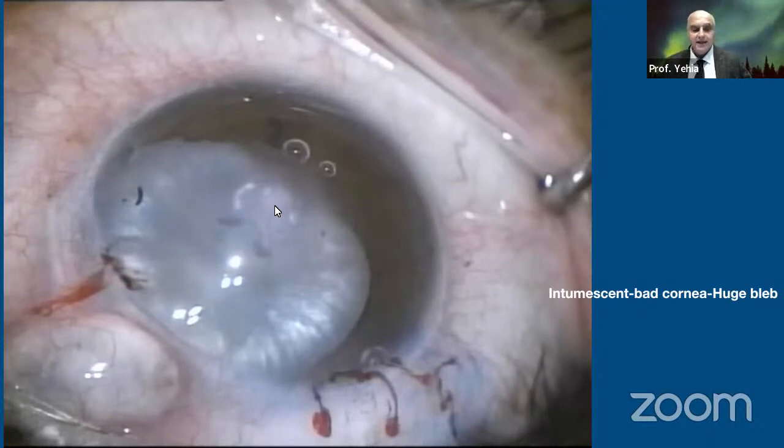One of them is this functioning bleb. Is it functioning or not functioning? We have to check the pressure. And if it is functioning and it's overfiltrating, you might be faced with a case of hypotony. Doing phaco surgery in a hypotonous eye is not easy because the anterior chamber tends to deepen and makes surgery difficult. It's not impossible, but you have to be aware of this problem.